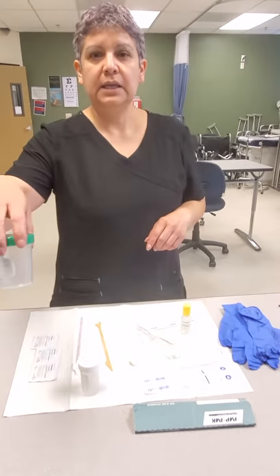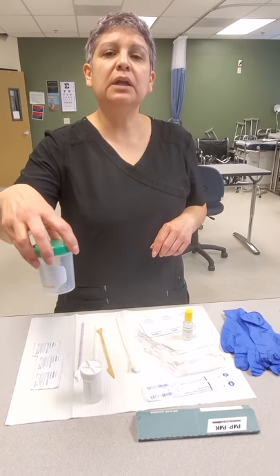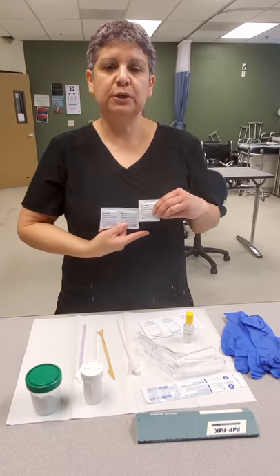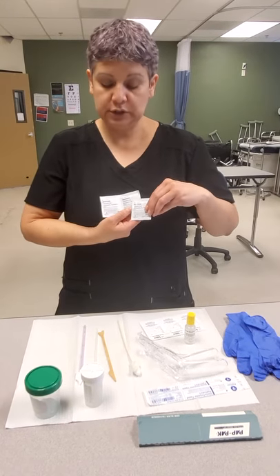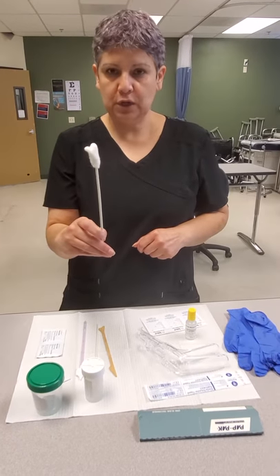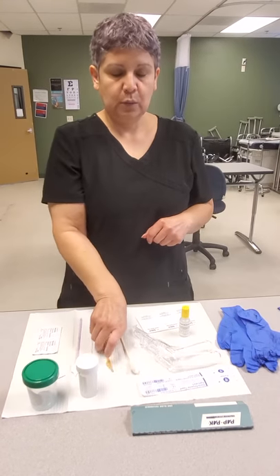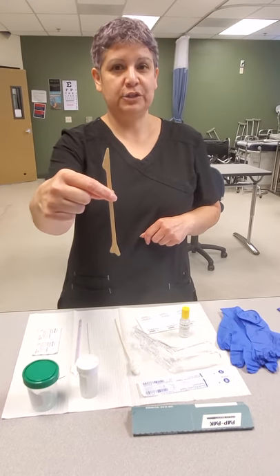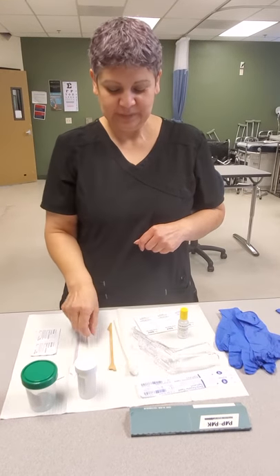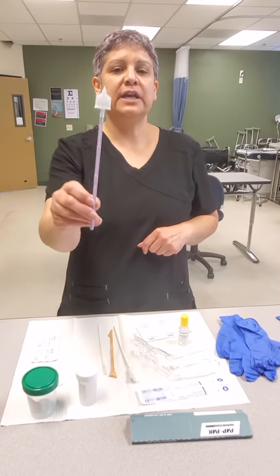We also have a specimen cup that we will collect a urine sample in. We have three obstetrical wipes that we will direct the patient to use. We have a large cotton tip applicator that we refer to as a pom-pom. We have a vaginal spatula, or cytology spatula. We have a cytology brush and a cytology broom.